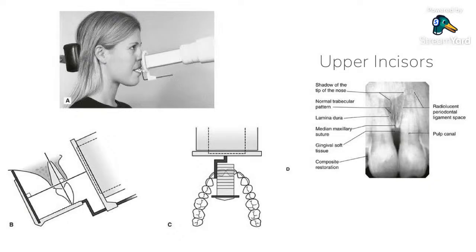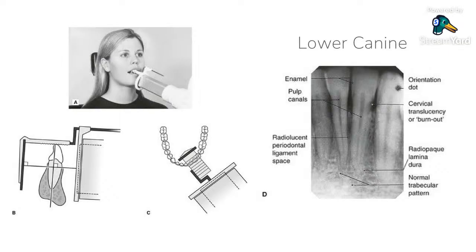Now like I said, the ring locator can be moved on the metal plate. Okay, so you want to keep the ring locator as close to the mouth as possible, and then you will bring the collimator on it, and then you will make an exposure and capture the image. You can see how crisp the image is. Okay, all right. Similarly with the lower, there is nothing as such different.